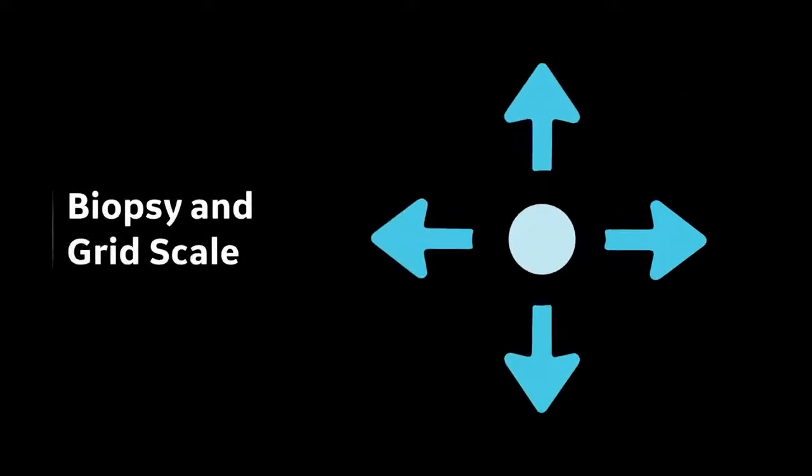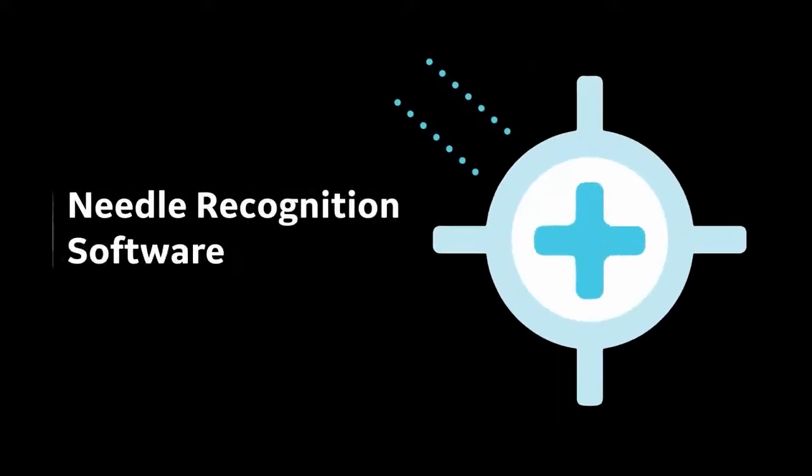Biopsy and Grid Scale easily calibrates with your system for interventional needle guidance, to assist you in positioning of the needle precisely during interventional procedures. Needle recognition software provides an accurate display of the needle, anatomy, and motion, to help you determine needed adjustments to needle gain and angle.